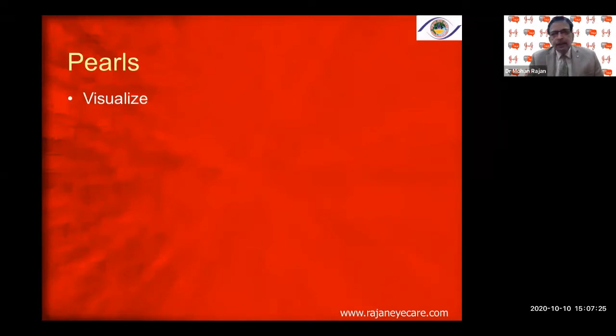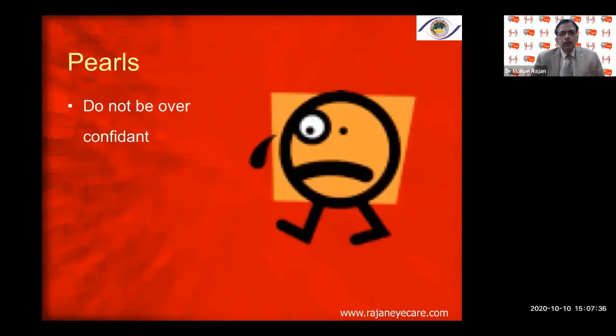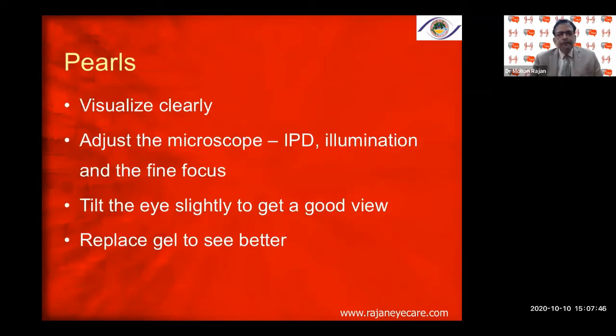Visualization is very important — unless you visualize the anterior capsule clearly, you will make mistakes. Do not be overconfident while doing the capsular rhexis; within a millisecond it can extend to the periphery, especially in the zonular area. Adjust the microscope IPD, illumination, and fine focus. Always ensure coaxial illumination for a good red glow. Tilt the eye slightly to get a better view, and replace the gel as needed.